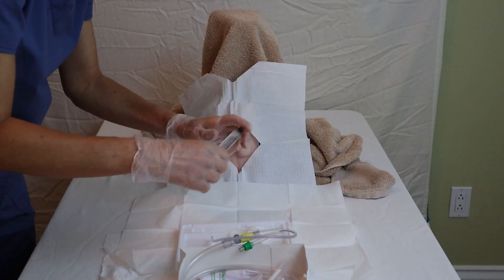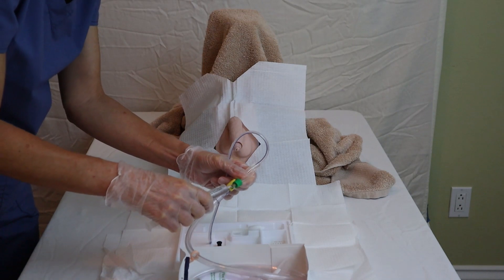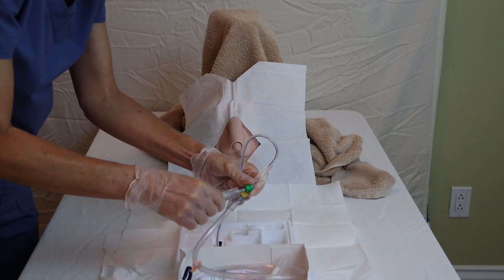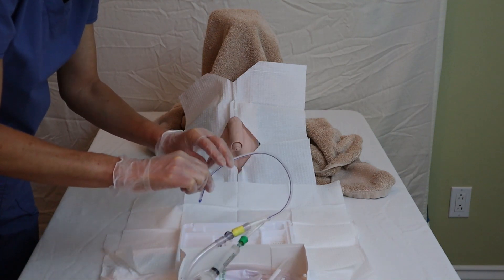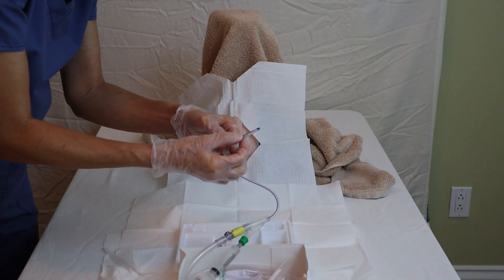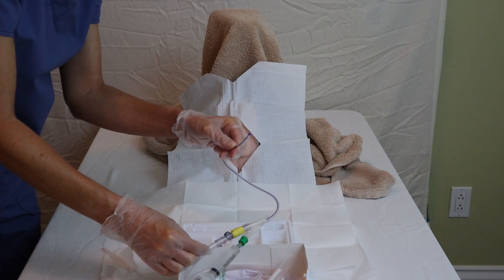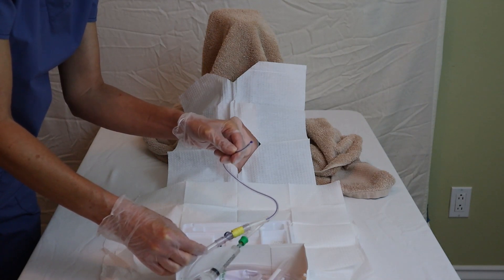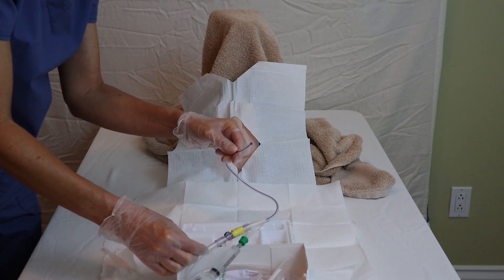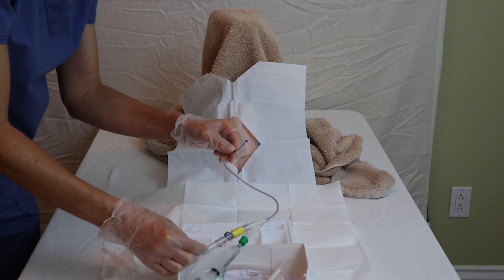I also want to take my pre-filled syringe and hook it up to the Y port, which will allow me to inflate the balloon once it is in place. The balloon is at or near the end of the catheter. Some manufacturers or hospitals will tell you to inflate the balloon before you insert it to test it, but that is mostly not common practice anymore, so we won't do that at this time.